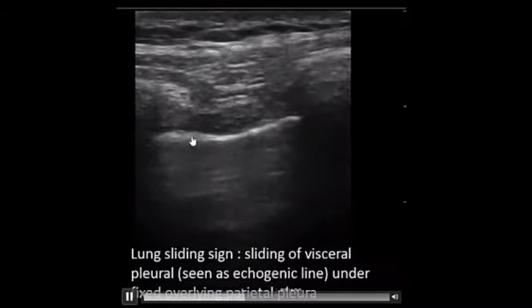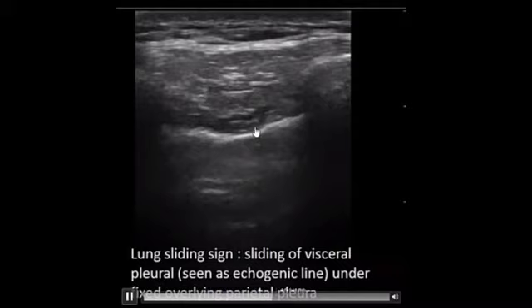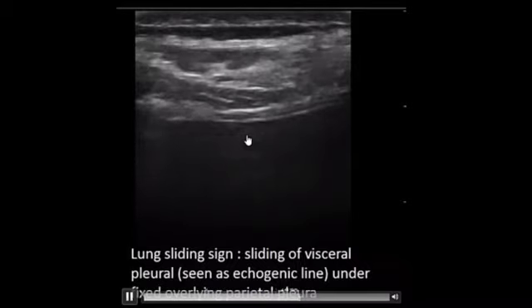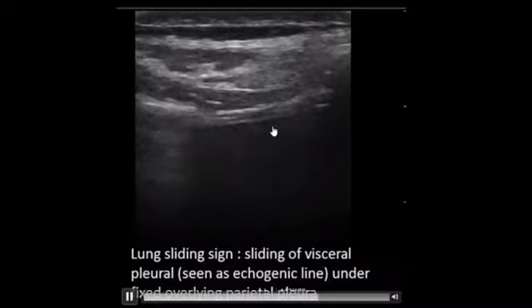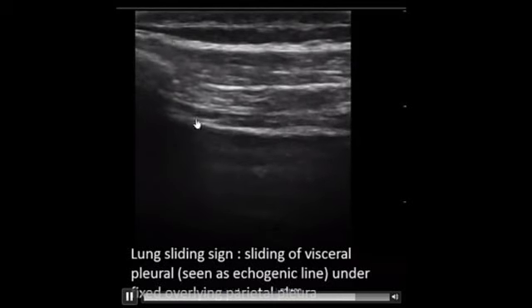This is the pleura which is sliding. It's a normal sign. Absence of lung sliding is significant and is diagnostic of many diseases. Now it's evident: lung sliding, sliding of the visceral pleura under the parietal pleura.